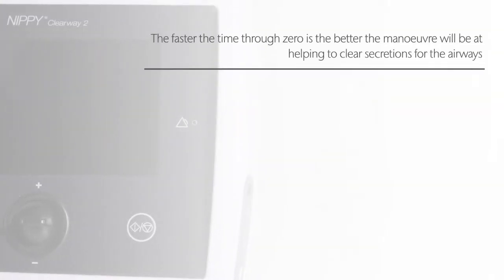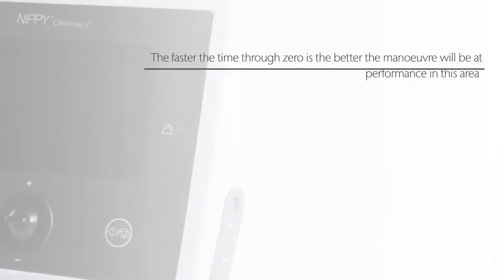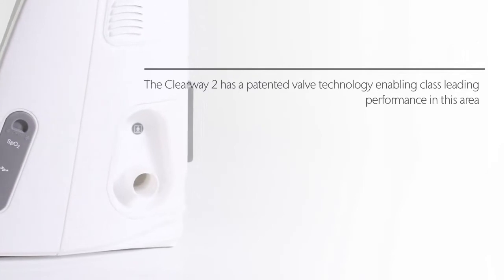The faster the time through zero is, the better the manoeuvre will be at helping to clear secretions from the airways. The Clearway 2 has a patented valve technology enabling class leading performance in this area.